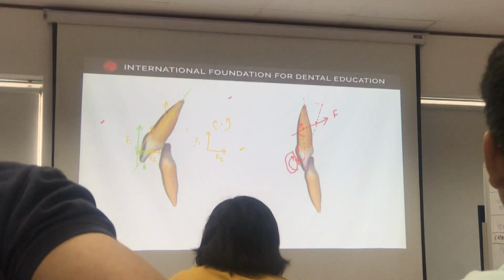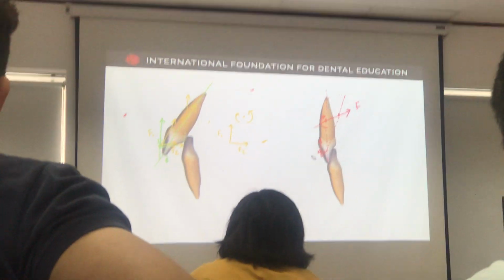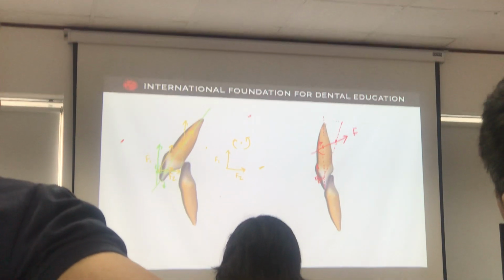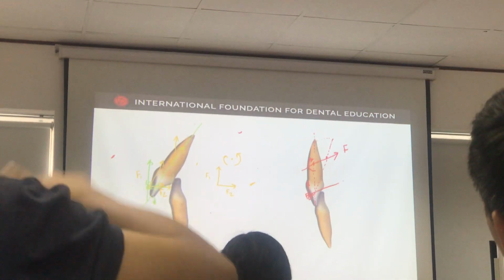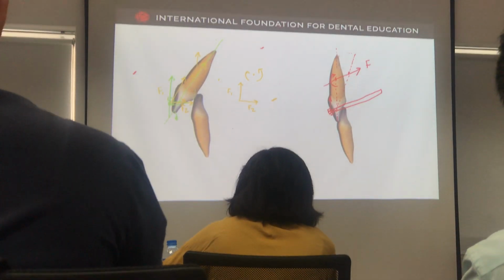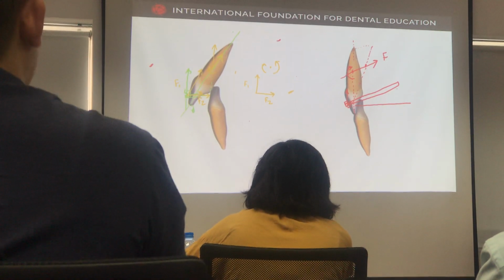At the beginning, then when the tooth change angulation, you go back to the system on the left. But at the beginning, what you can use is called a torquing arm. So you put a piece of 1725 again or 1925 into here, okay? And you tie it to a wire that's there.